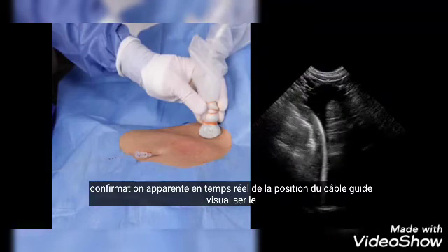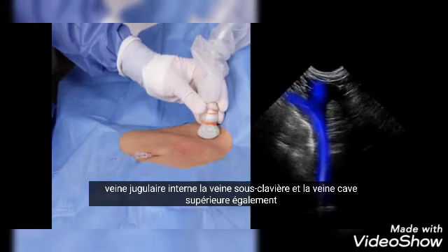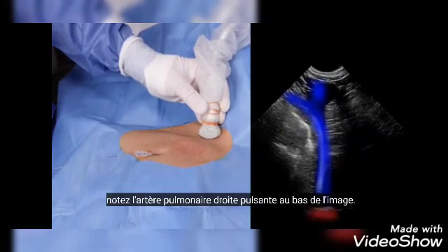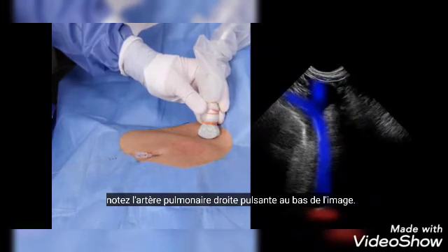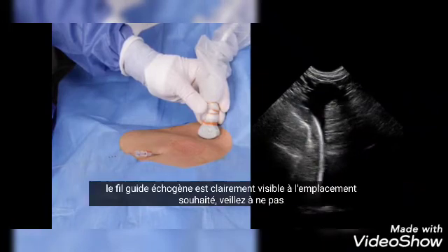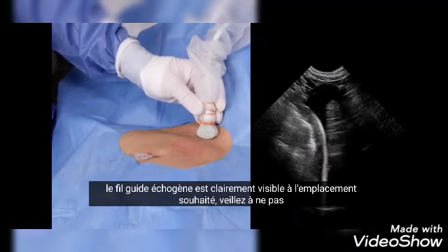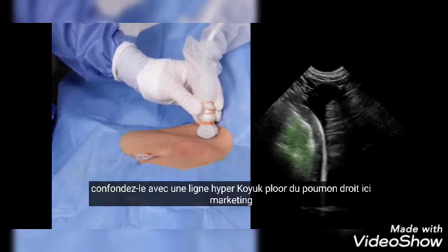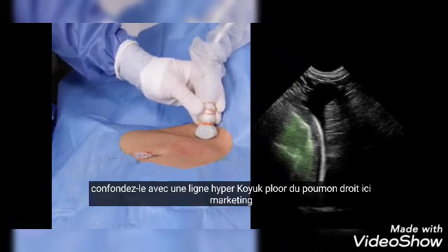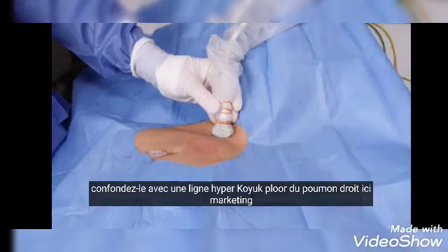As we tilt the micro convex probe caudally, the main benefit of this technique becomes apparent: real-time confirmation of the guide wire position. You can visualize the internal jugular vein, the subclavian vein, and the superior vena cava, as well as the pulsating right pulmonary artery at the bottom of the picture. The echogenic guide wire is clearly visible in the desired location. Take care not to confuse it with the hyperechoic pleural line of the right lung, marked in green.